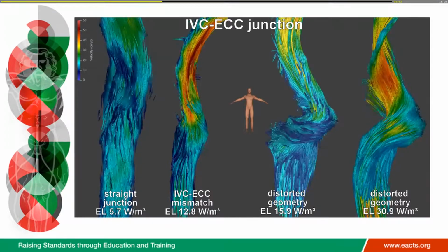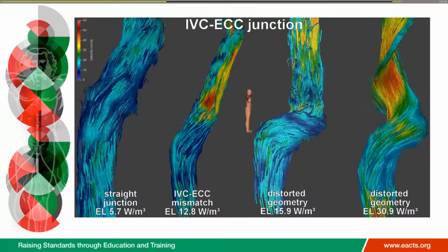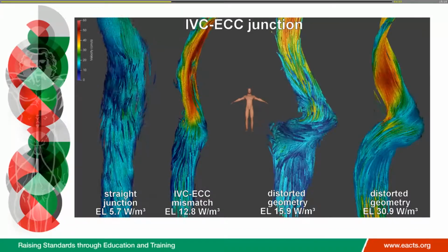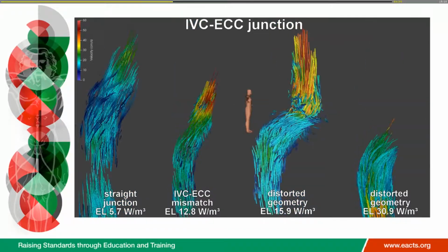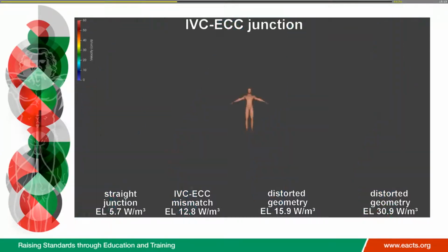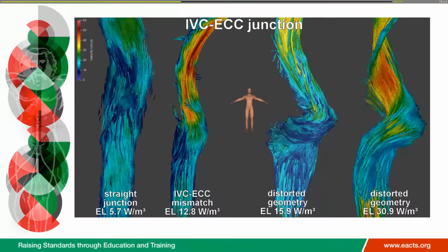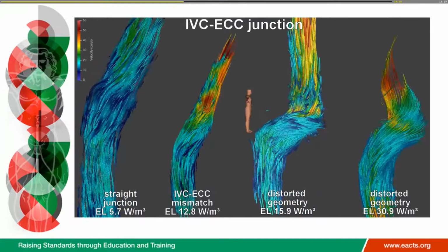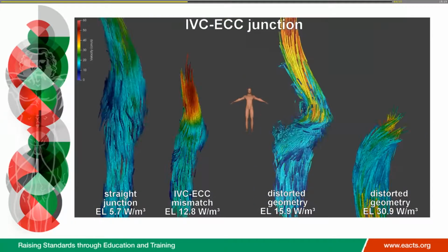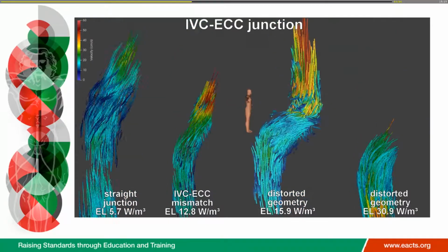In follow-up to this question, did you confirm that this 16 millimeter or the mismatch was not, or the deformed geometry was not the surrogate for this turbulence? That not the 16 millimeter, but the non-straight geometry was the cause for the turbulence. I'm maybe not clear. You know, there are straight grafts, straight flow with 16 millimeter. Yeah. And there are deformed geometries with 16 millimeter. Yes. Do you think what is important? Is it 16, or the mismatch is important, or the geometry is important?